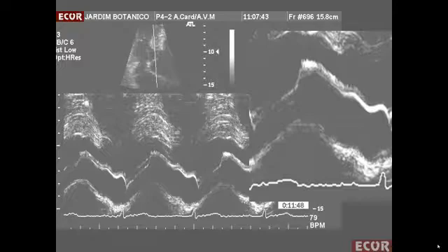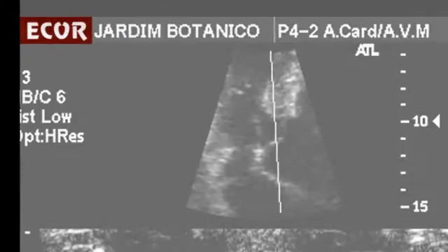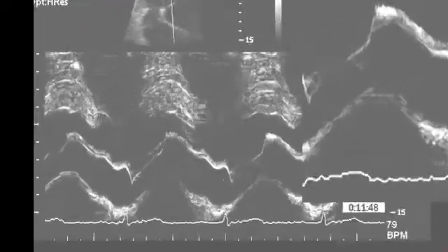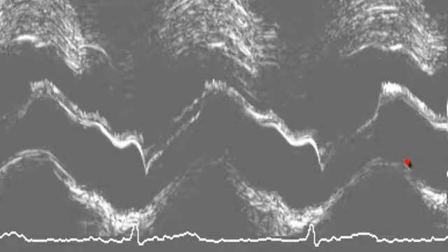Look at this aortic valve. 2D echo normal, no vegetations seen in a patient with clinical suspicion of endocarditis. A thorough M mode scan of all valves was performed. The aortic valve presented classical torn paper sign.